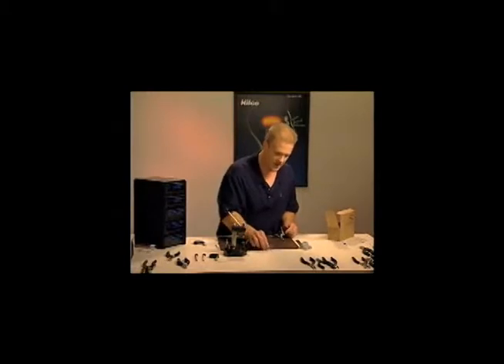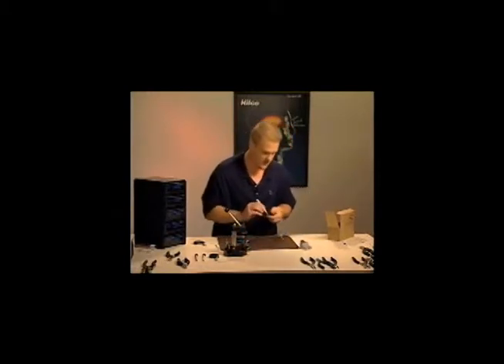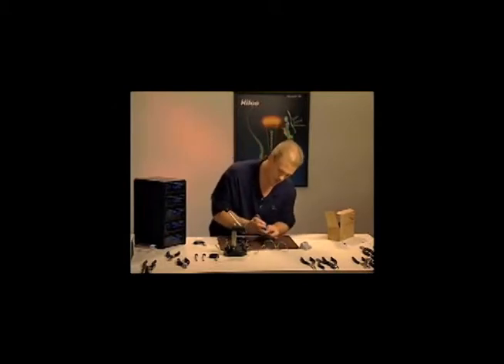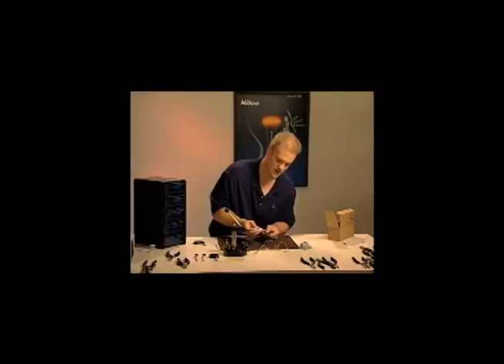I want to find the diameter of this screw. And the fast find gauge also has holes in the ruler where you can pass the screw through the holes to find one that fits snug. There it is. It's a 1.4. So I know what diameter repair screw that I need. I'm going to go to a 1.4.